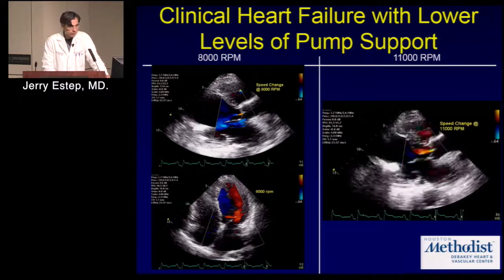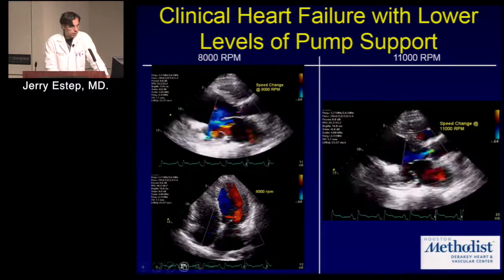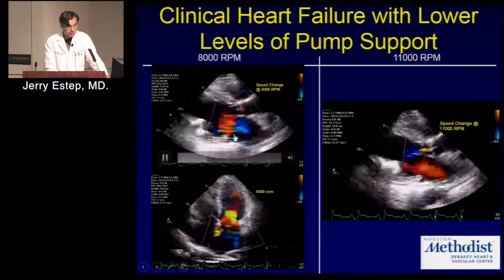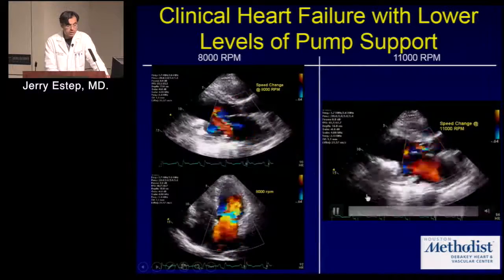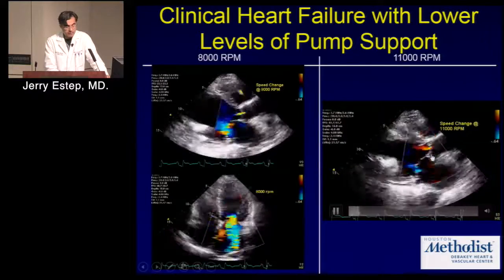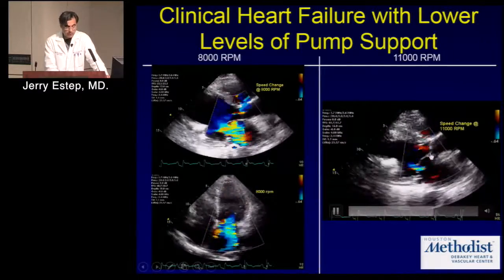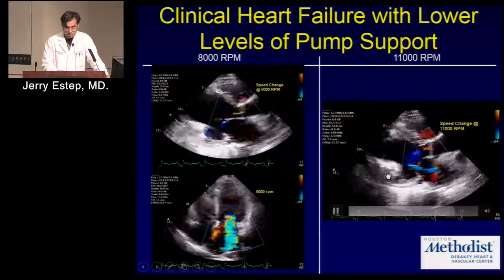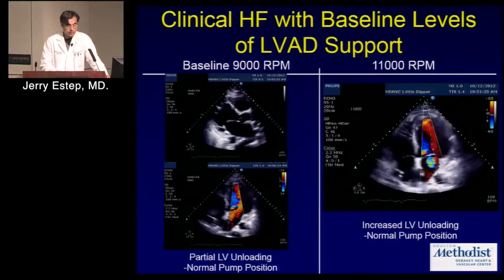So this is just an example of someone at a lower pump speed. This is the same case of inflow cannula malposition, significant persistent mitral regurgitation. And it really, if it's at the expense of persistent aortic valve closure and some AI, MR is significantly reduced by increasing the pump speed. And so this translated for this particular patient to less shortness of breath.